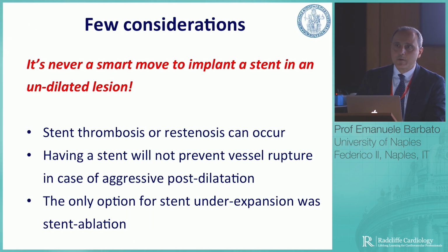When we had this problem in the past, before intravascular lithotripsy, the only option was to perform stent ablation. This is not the kind of procedure, for those of you who have done this, where we are really happy to do it. We do it because we are forced to do it.